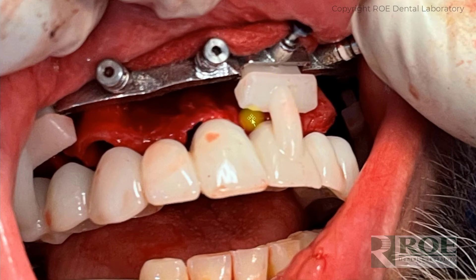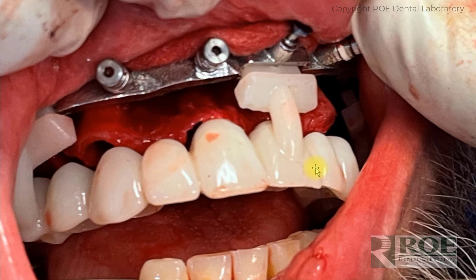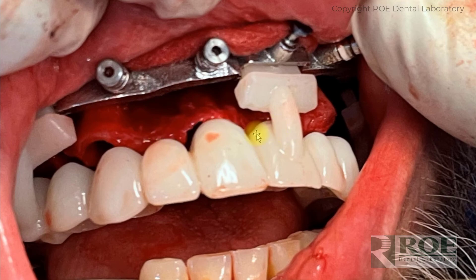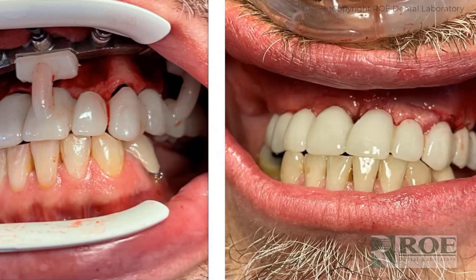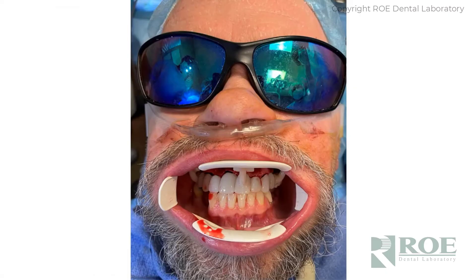In this case, once the prosthetic was seated the doctor simply drilled the implant sites through the prosthetic — these were all straight implants. That's a very rare thing. Most of the time the doctor will use our osteotomy guide, but he knew exactly where he wanted them to emerge because there were holes in the prosthetic, he knew the bone architecture, and he could visualize it. His comfort level was to seat the implants and then deliver the prosthetic. It's not a recommended process, but for this doctor it worked out really well — and there's a final image on the right showing a lovely delivery.